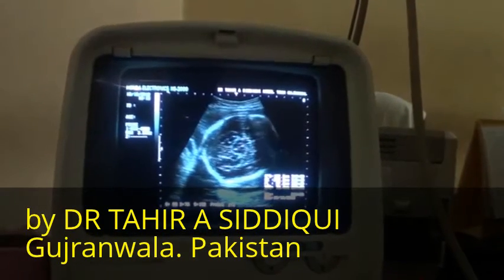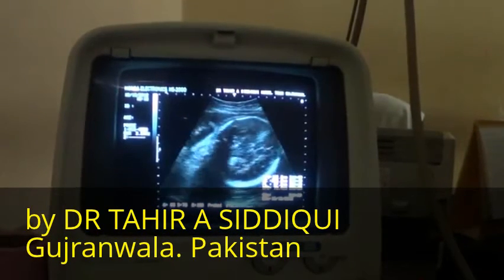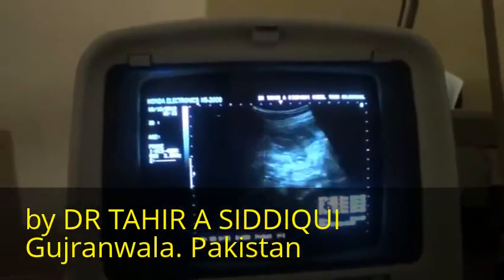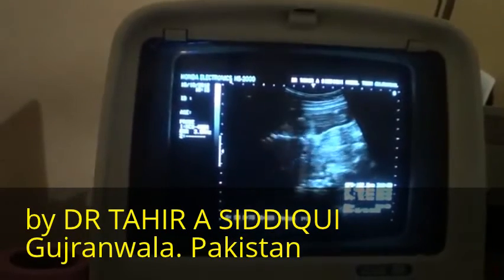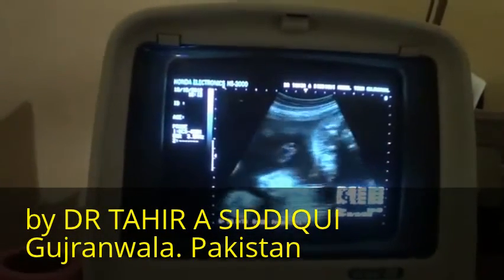All the internal structures of the brain are seen normal. This is the neck region, and in this region we do see an anomaly.